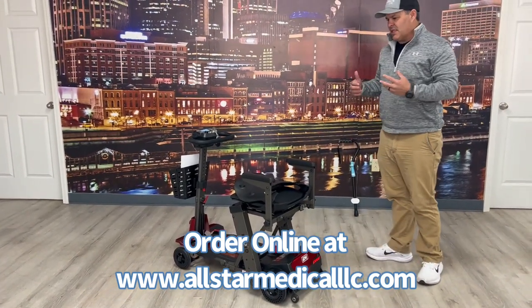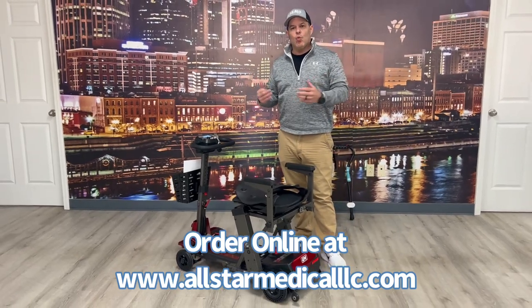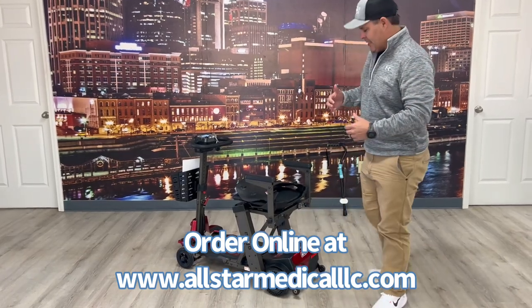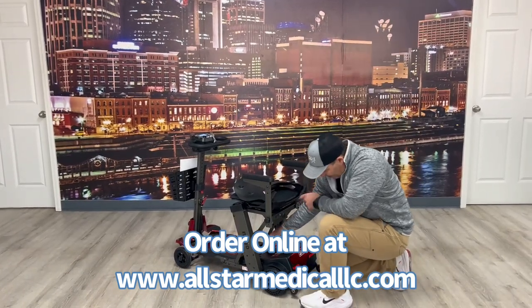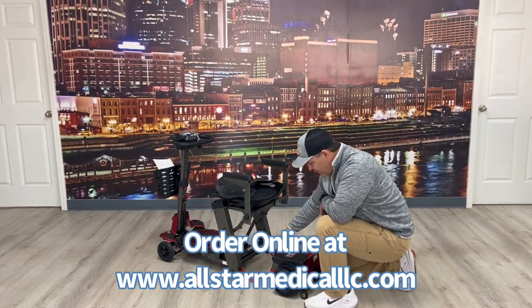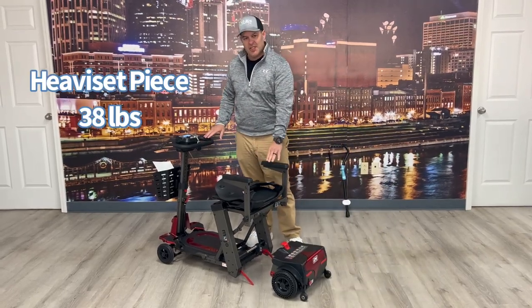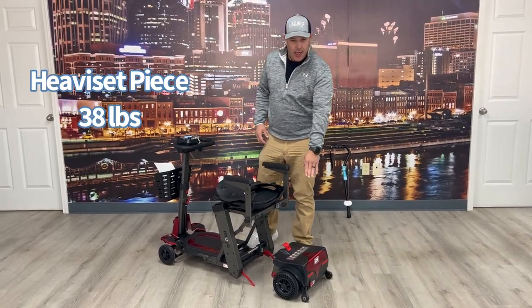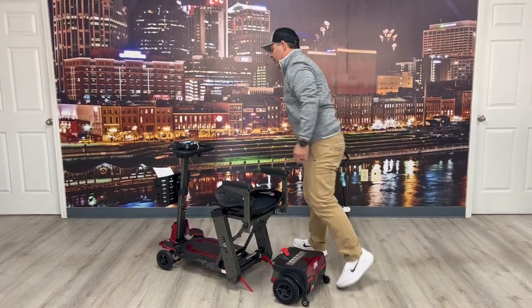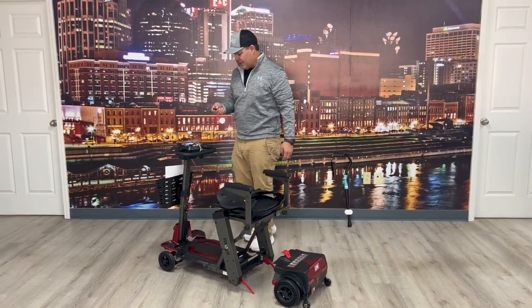Another nice feature that's different from most auto-folding scooters — almost all auto-foldings are one unit, but this one actually has a detachable back end. I can pull this little lever right here and slide it off. So now the heaviest piece is 38 pounds, which is the rear section, and the lightest is 20 pounds for the front. I can still fold it in this situation as well.